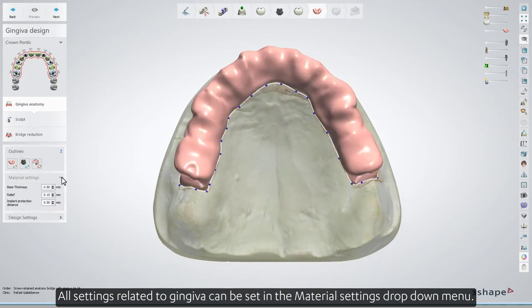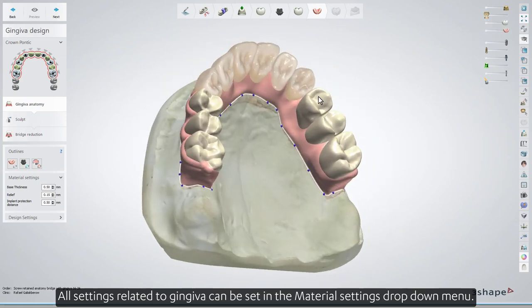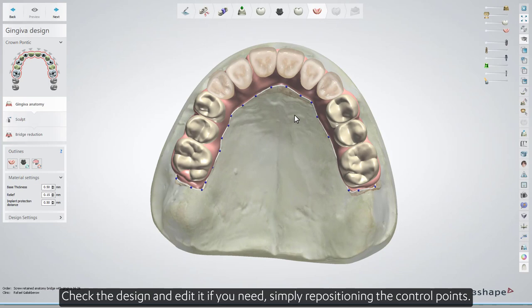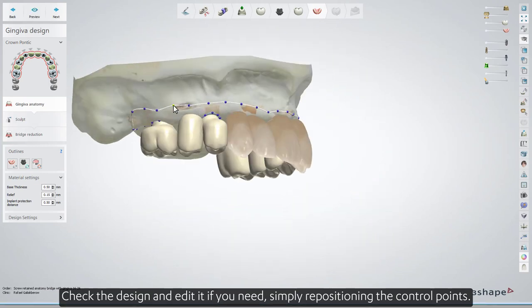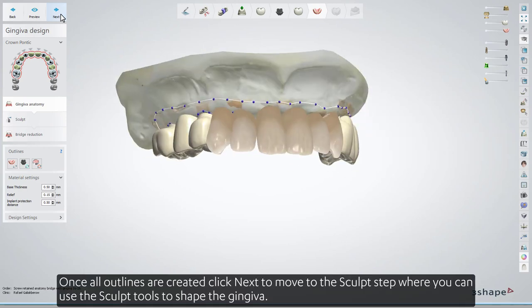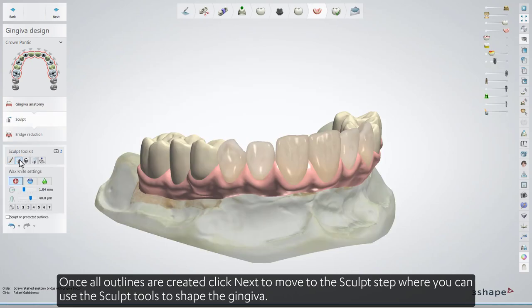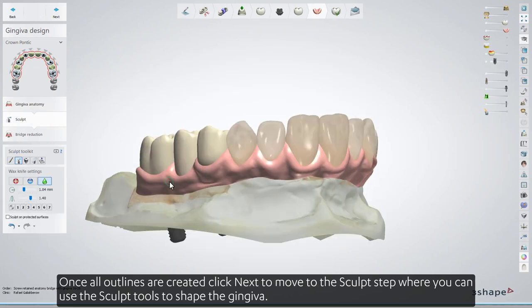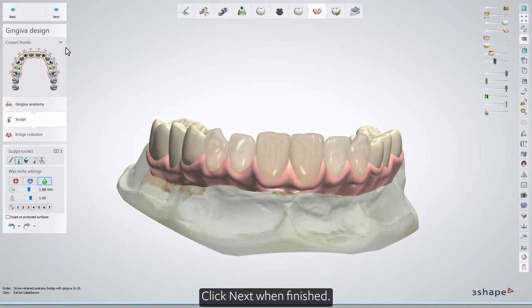All settings related to gingiva can be set in the Material Settings drop-down menu. Check the design and edit it if needed, simply repositioning the control points. Once all outlines are created, click Next to move to the Sculpt step, where you can use the Sculpt tools to shape the gingiva. Click Next when finished.